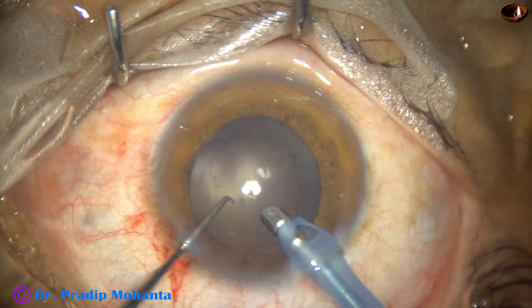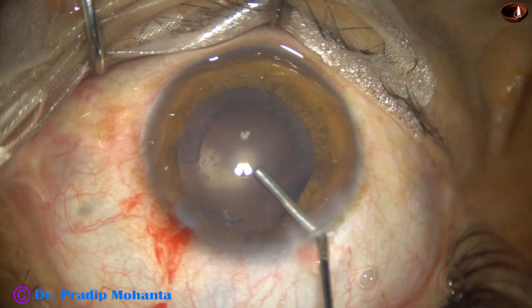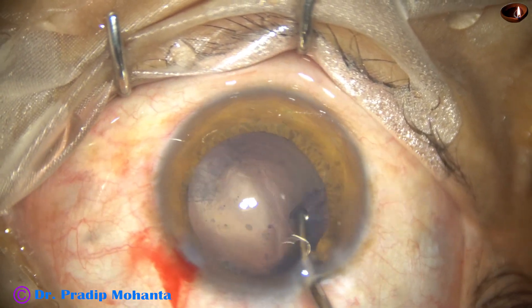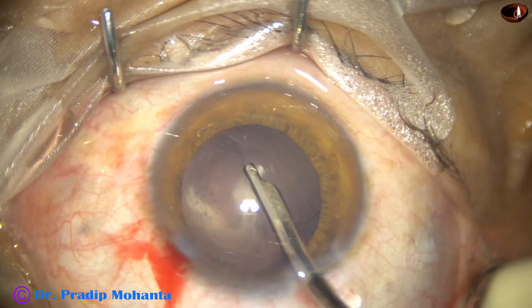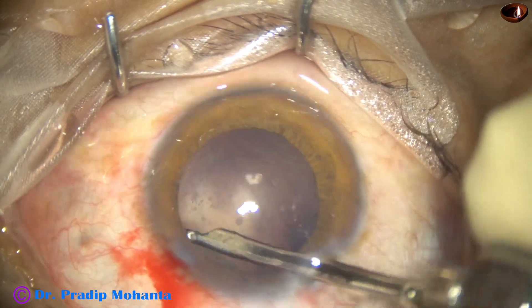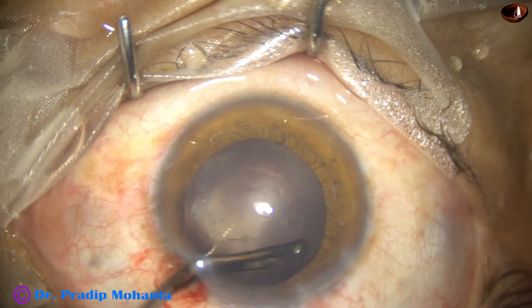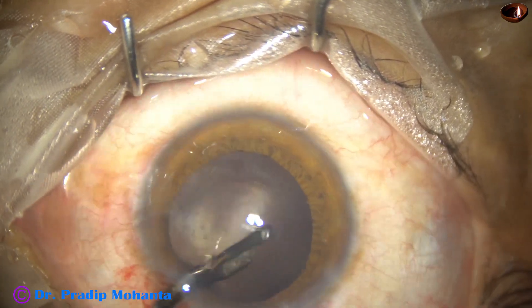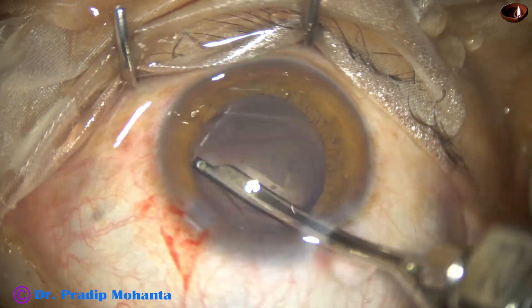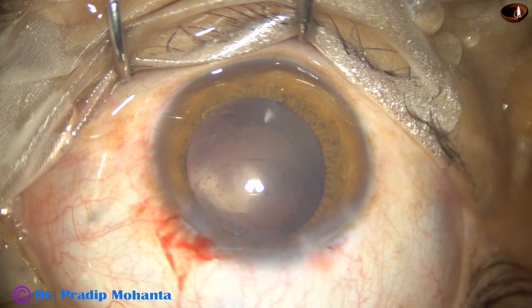The nucleus has been managed. Now cortical cleanup needs to be done. We have only one side port and I am using the 23-gauge Simcoe for removal of the cortex. In silicon oil-filled eyes you will see some black areas on the posterior capsule — this is some pigment sticking to the posterior surface of the posterior capsule, and those black spots cannot be polished out. The polishing of the posterior capsule has been done as far as possible.